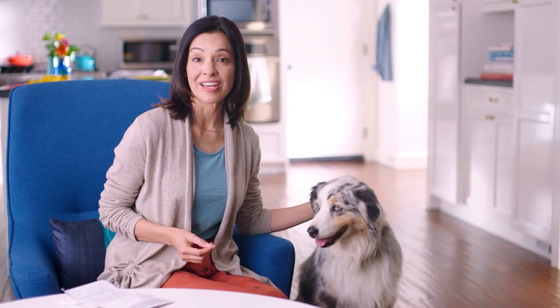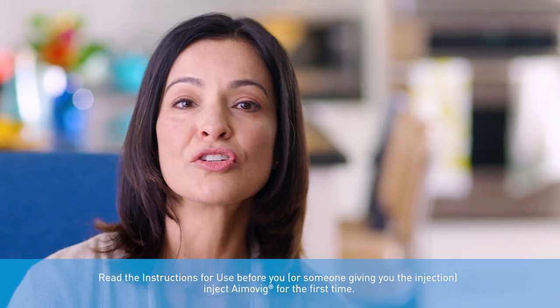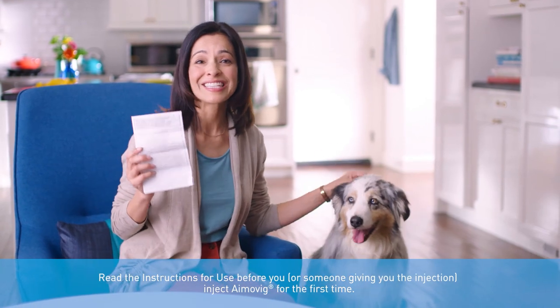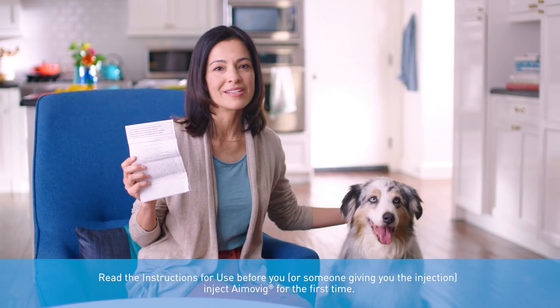Like you, my doctor prescribed Amovig for me. First thing, her nurse showed me how to inject and said it was really important before I inject myself for the first time that I read and understood the instructions for use, or IFU for short. It comes with the medicine. Definitely read it all — it covers everything you need to know about how to inject with your auto-injector. There's even a commonly asked questions section in case something goes wrong.